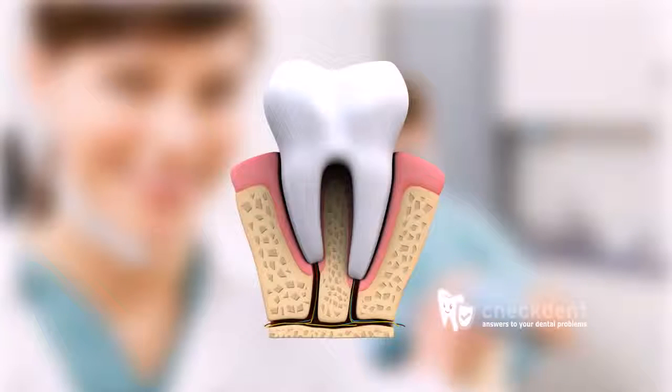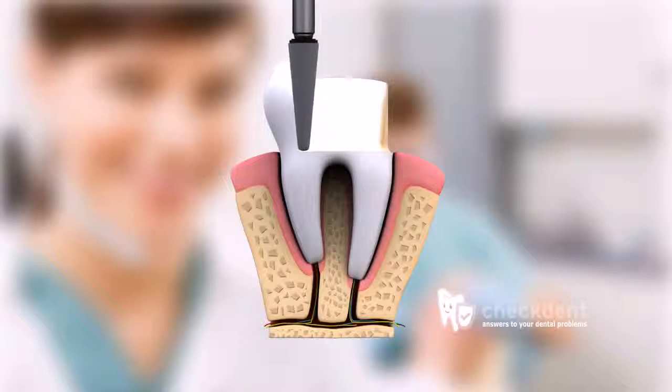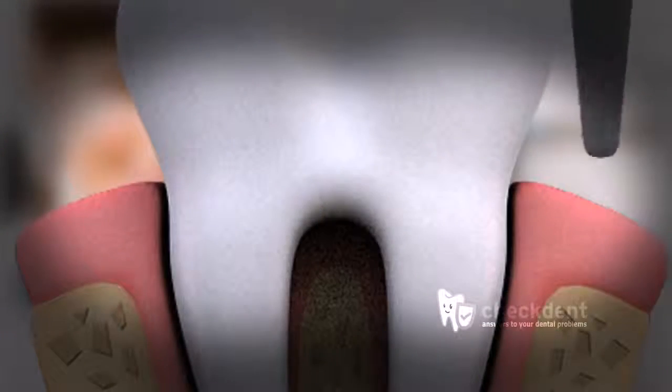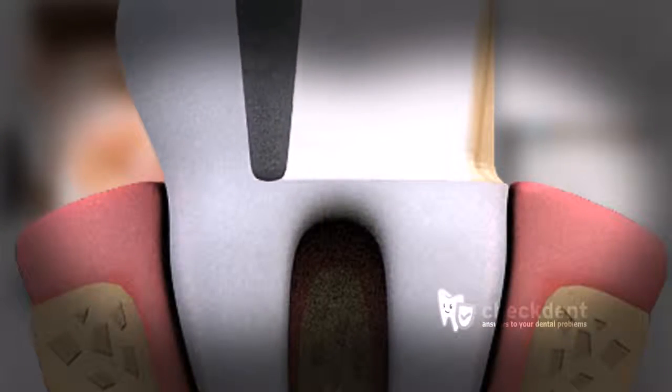In the round margin abrasion technique, the advantages of the other techniques are combined, and the disadvantages are eliminated. However, this technique is the most complex. The adhesive can flow easily during cementation. This allows for a thin joint. The technician has enough room for the ceramic, and the edges are tightly closed, preventing food lodgement. To achieve a round margin, cutting must be performed under magnification.